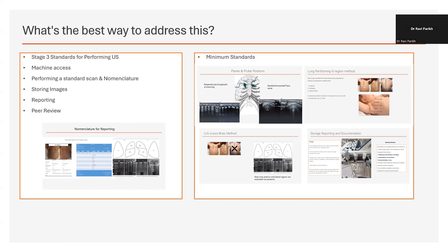And then if you start doing horizontal or transverse scanning in each rib space, my dear, I've ended up doing 64 images on a baby recently, and they were very important because that baby had very patchy pneumonia, which was only picked up when I went into each individual intercostal space properly. So it can be a lot of images that you have to store and report on.